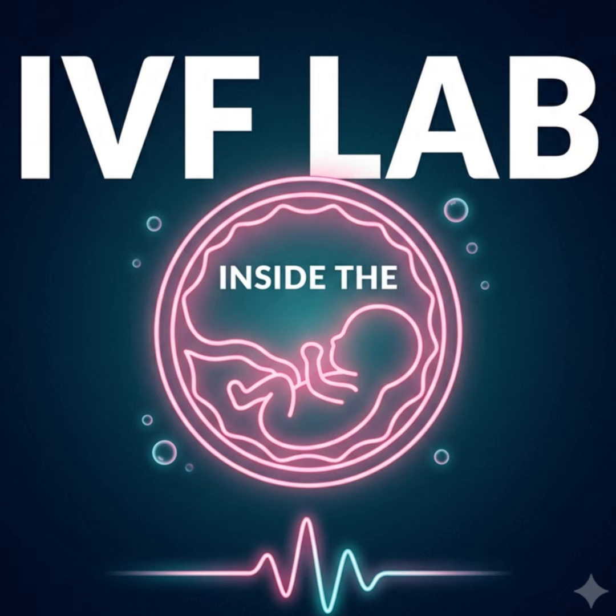The IVF laboratory is engaged in a constant, exhaustive effort to mimic that internal perfection. So when that dish comes out of the incubator for its daily snapshot, what is actually happening to the embryo on a cellular level, like physically? 3 major critical environmental pillars are immediately threatened: temperature, pH stability, and gas consistency. Let's start with temperature because it is the most immediate.